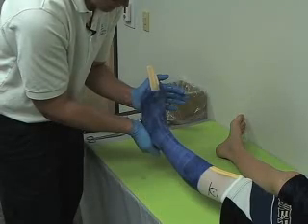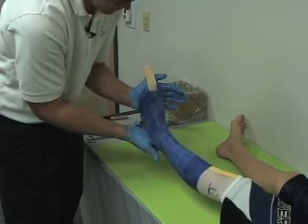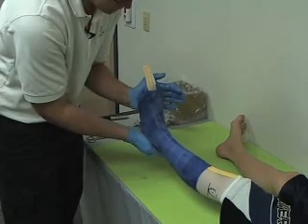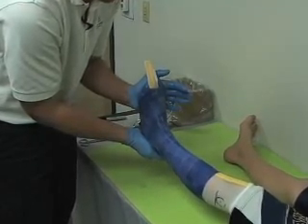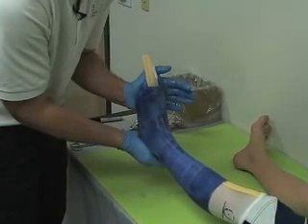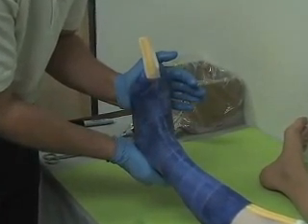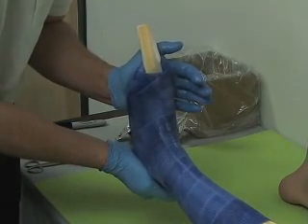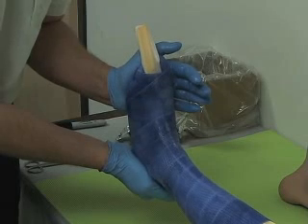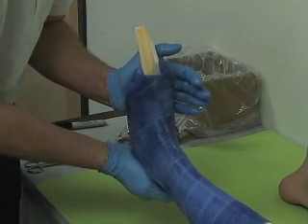Once you get the casting material on, it is very important to get the R1, the vertical heel, and the forefoot supination in alignment as close as you possibly can. If you have a child that is going to fight you, it is important to get the hindfoot vertical. If you need to fudge, fudge on plantar flexion — that is very easy to adjust. But get the hindfoot-forefoot relationship locked in. Worry about the plantar flexion-dorsiflexion angle, or R1, last.